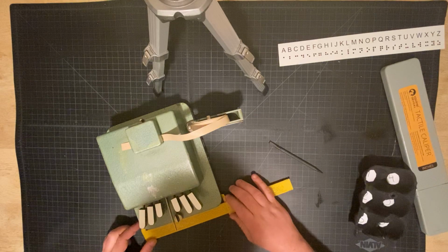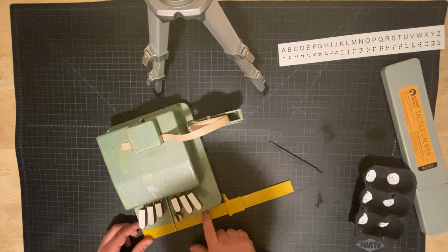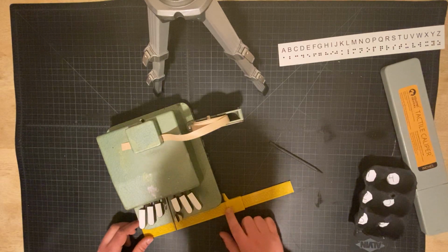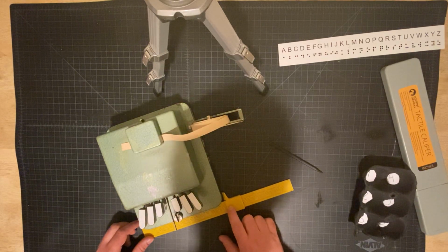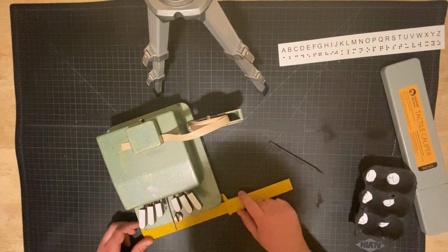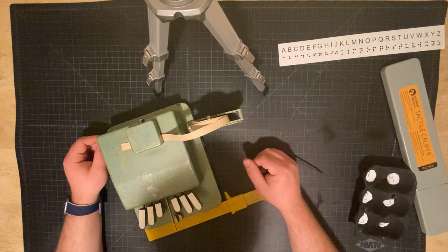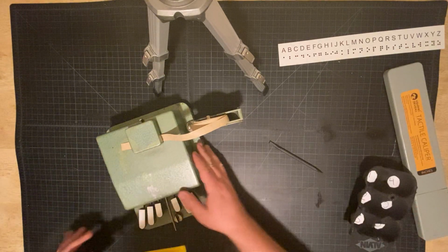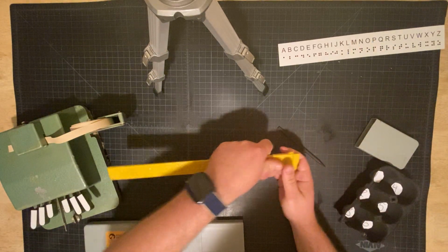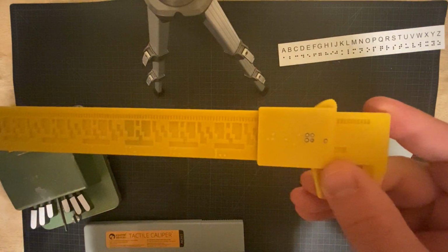So this one, the width of this brailer is 1, 2, 3, 4, 5, 6, 7, and just working on my braille here. 7 and 9/16 inches. Is that right? Yeah. Oh boy. So that is the Squirrel Devices caliper, and it has a nice case you can put it in. And yeah, so I'll just leave the last view being it changing.